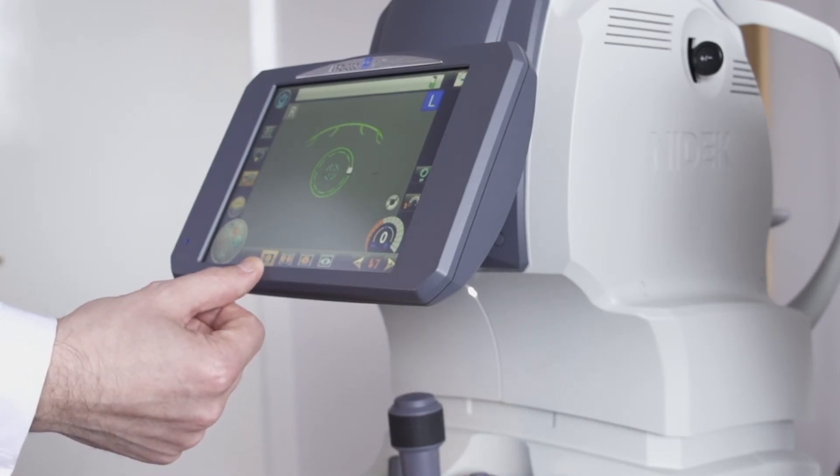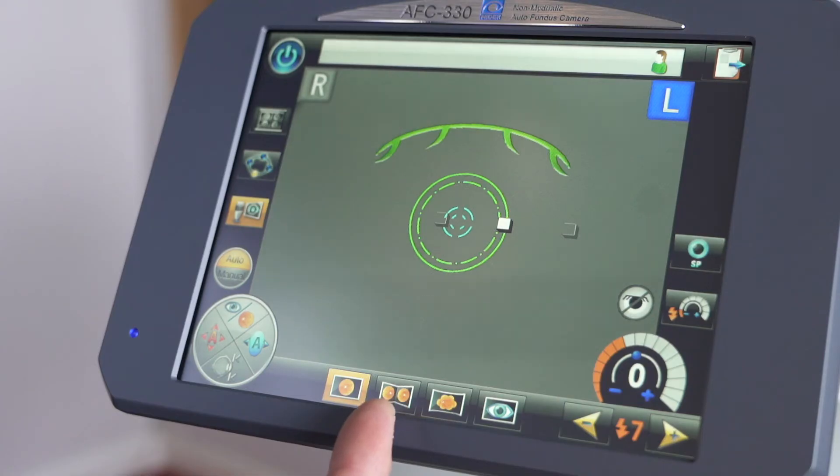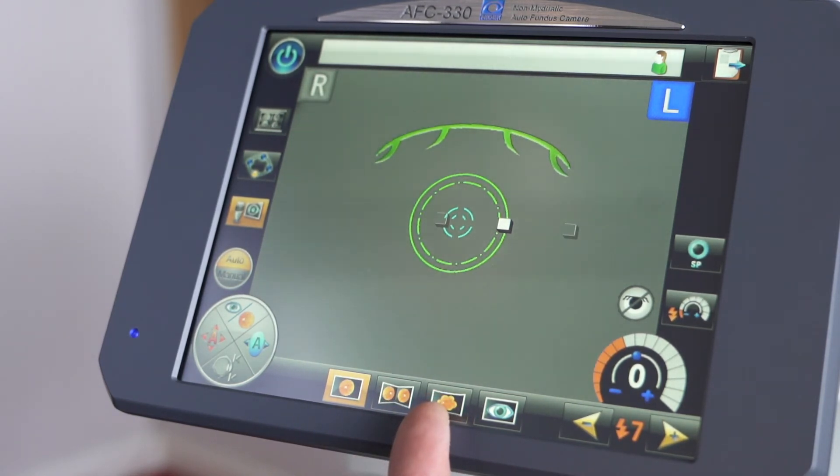This is our standard one shot of the fundus. This icon is able to take a stereo image of the fundus. This icon allows us to take a panoramic shot of the fundus. And this icon allows us to take an anterior shot of the eye.